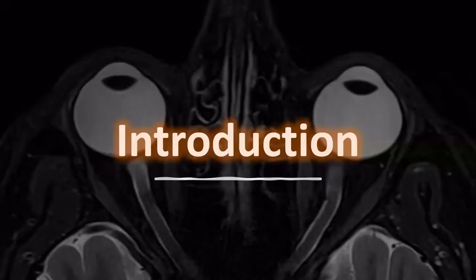And let's get started with a short introduction. What are indications for orbital imaging? Why is orbital imaging performed? There are three recurring reasons for performing imaging of the orbits and or visual tracts, and it's important to know what the exact indication is to give the patient the best possible MRI examination.